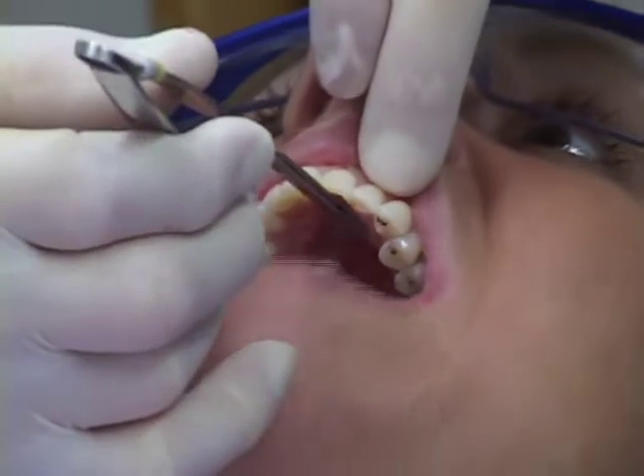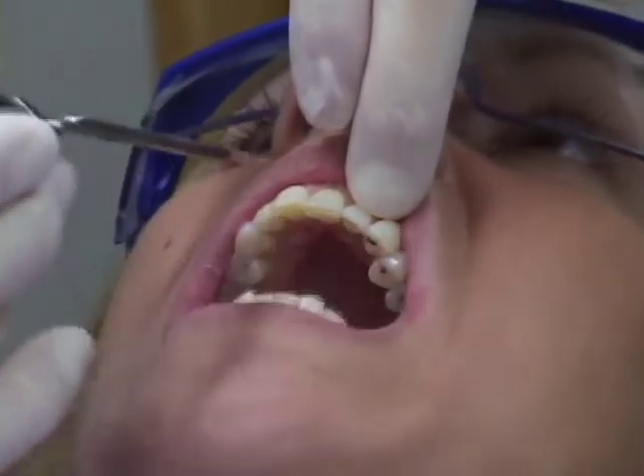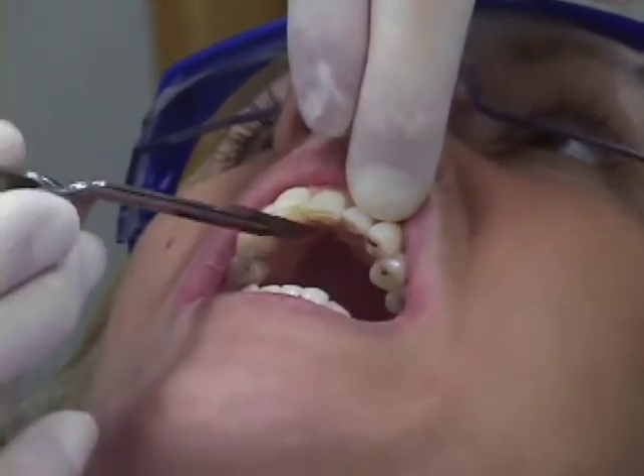In Debbie's situation - well, in any situation - we would like to not have solid stops. Unlike some others believe, we don't really want solid stops. We would like to have the 8-micron shim very lightly pulled through on all the anterior teeth.